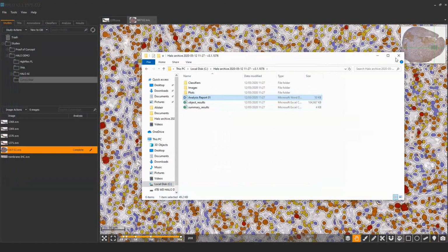I will probably pause the train there as it's reached the end of the session. We've got a few options available to you. We can arrange another session to do some additional things that we missed, such as TMA, spatial analysis, Halo AI, maybe some advanced options and annotations. And then we can also do follow-up sessions for individual troubleshooting for images.